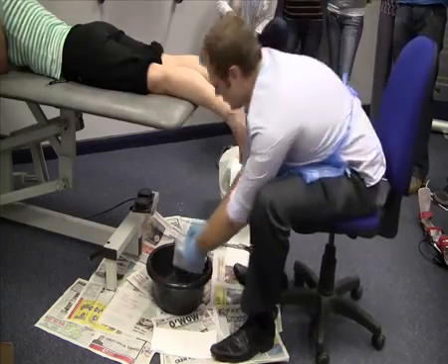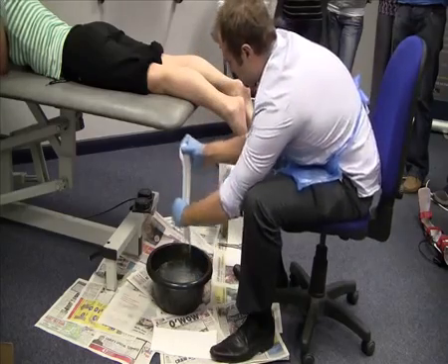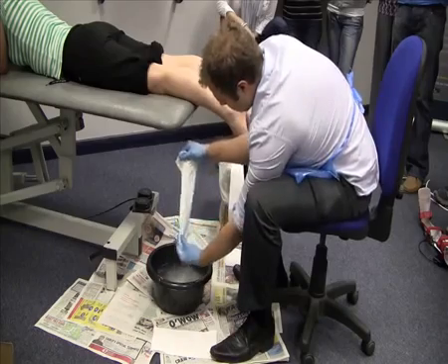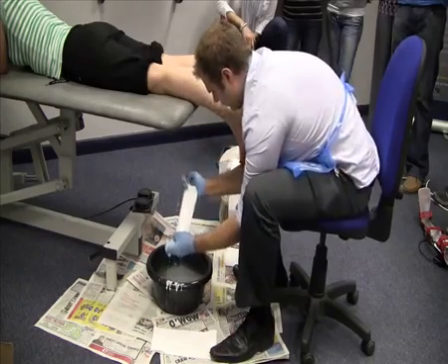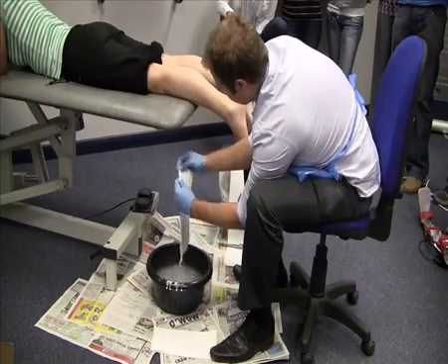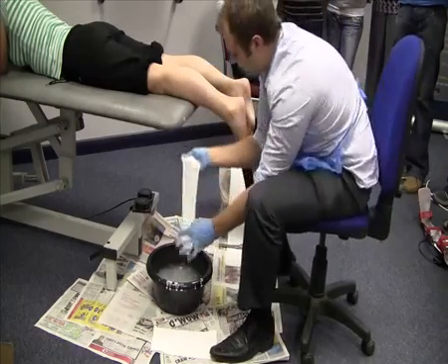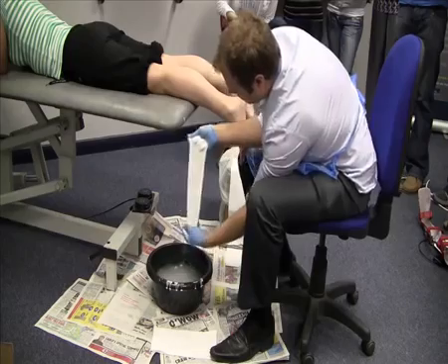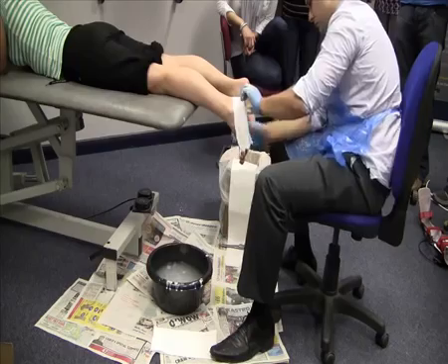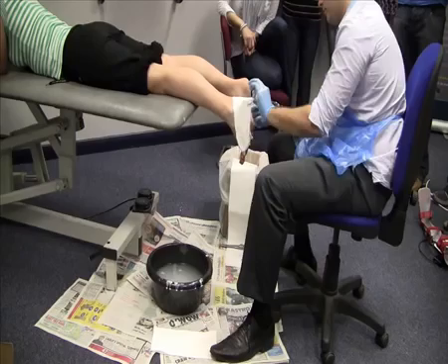Submerge it in the water. Wring out. Smooth down all the plaster. Fold over an edge for when you remove the cast. This is quite a weak and flimsy plaster. Drape over the foot and pull out from the heel.